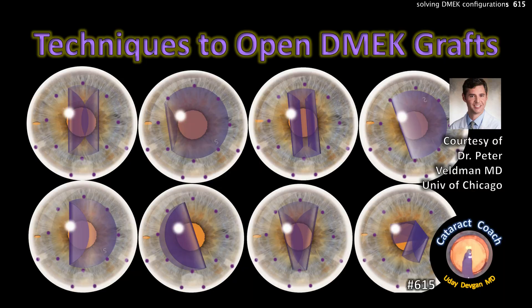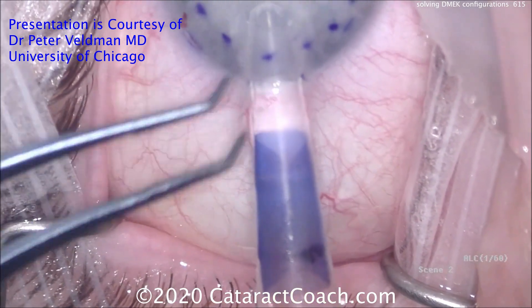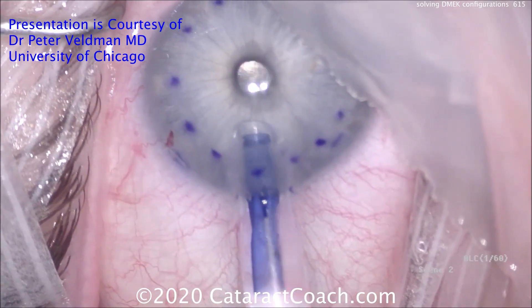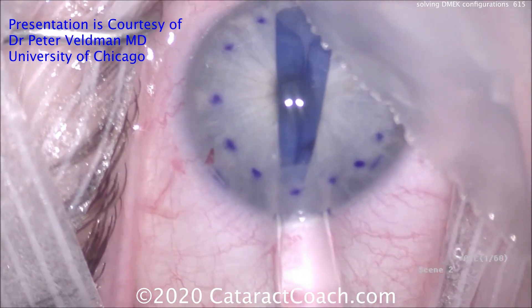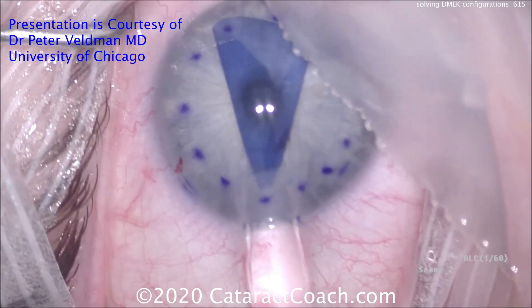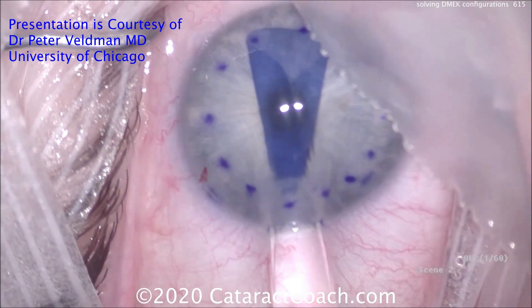From cataractcoach.com, techniques to open DMEK grafts courtesy of Dr. Peter Veldman from the University of Chicago. Dr. Veldman inserts a DMEK graft — Descemet's membrane endothelial keratoplasty — and it goes into the eye easily. The Jones tube is right up against the incision. Using the second hand to flatten the anterior chamber by tapping on the paracentesis lowers anterior chamber pressure, helping the graft stay in place.